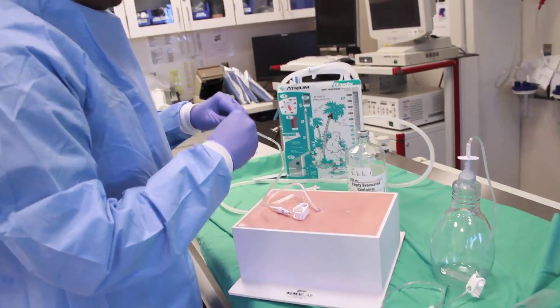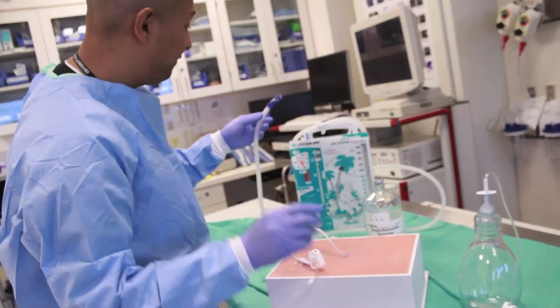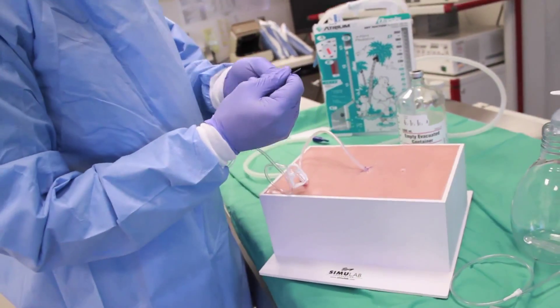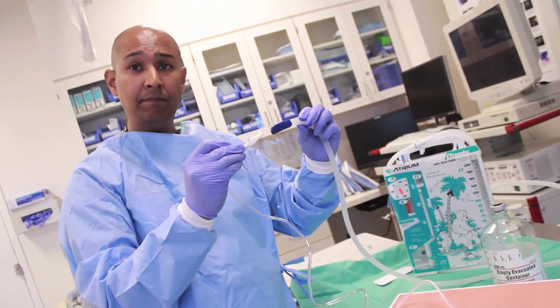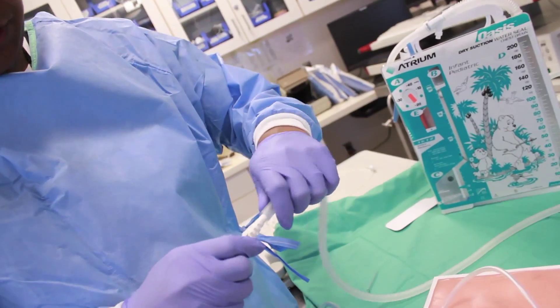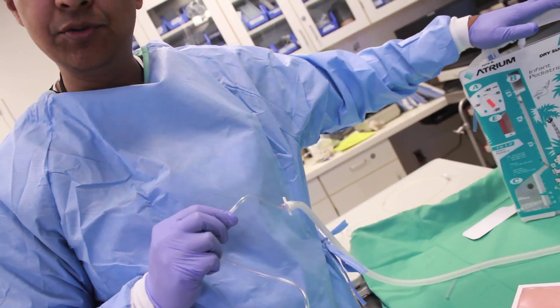Another option is a chest tube suction pleural vac. The pleurex kit includes a Christmas tree connector which attaches to the end of the tubing from the kit. To connect to the pleural vac, use a scalpel to trim the tubing end so it fits onto the Christmas tree device, creating a good seal that can then be connected to suction. Please follow these steps to successfully place your pleurex catheter. If you have any further questions, please visit my website.